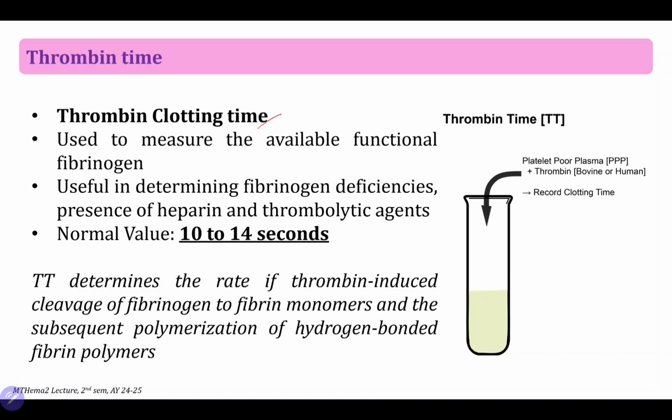This is used to measure the available functional fibrinogen and is also useful in determining different fibrinogen deficiencies such as afibrinogenemia, dysfibrinogenemia, and another one, hypofibrinogenemia. Okay? Aside from that, this is also useful in determining the presence of heparin and other thrombolytic agents.